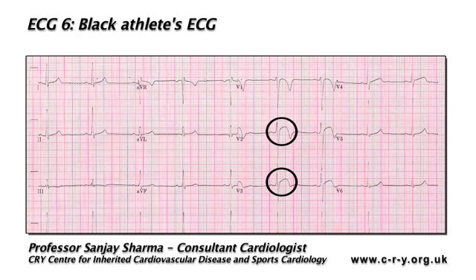However, one should consider his ethnicity. The presence of convex ST segment elevation in leads V1, V2, V3 and associated T-wave inversions in these leads are common in Black athletes and are present in 25% of individuals in this ethnic group.